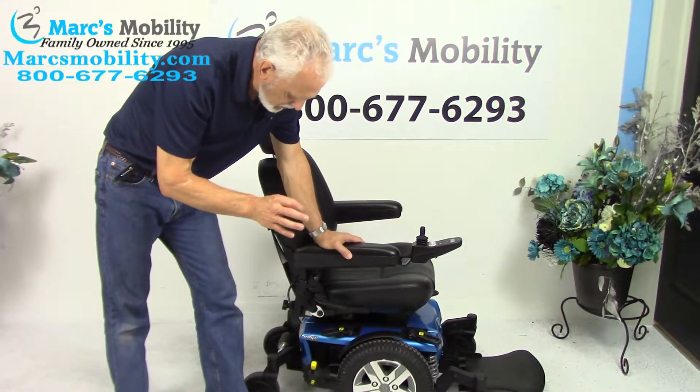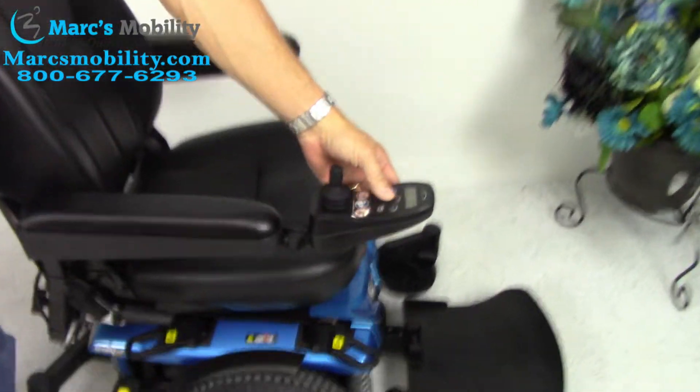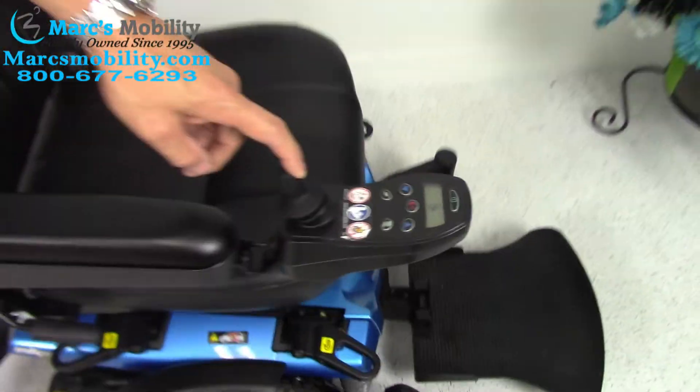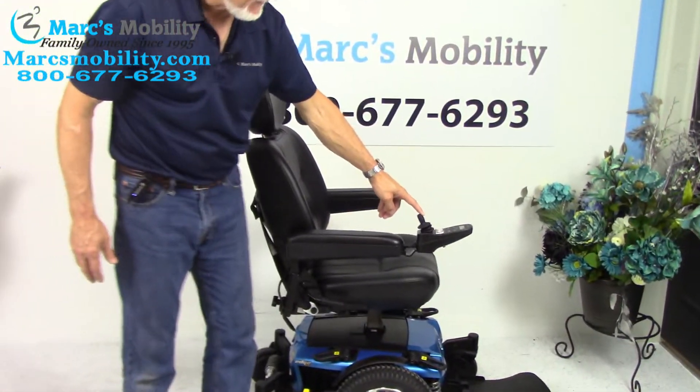So the first thing I'm going to show you is how to make the seat lift go up. You would go to the joystick and press the blue button. As soon as you see a picture of the seat, your seat is ready to go up. Then use your joystick right here, push it back, and now you've got your seat lift going up.